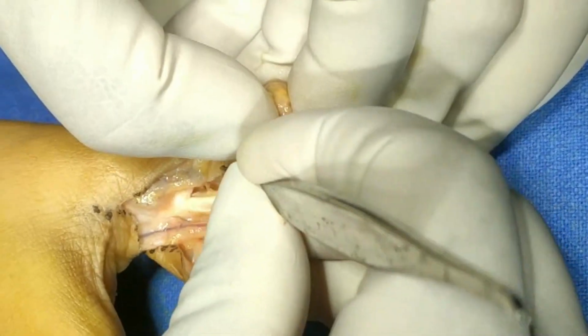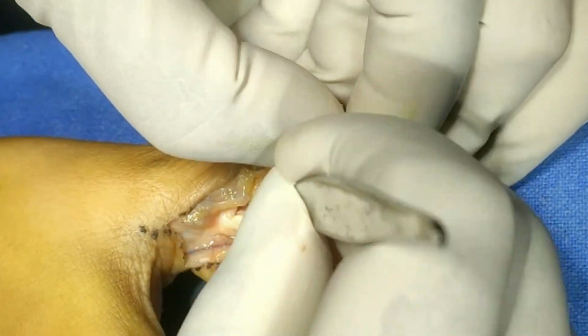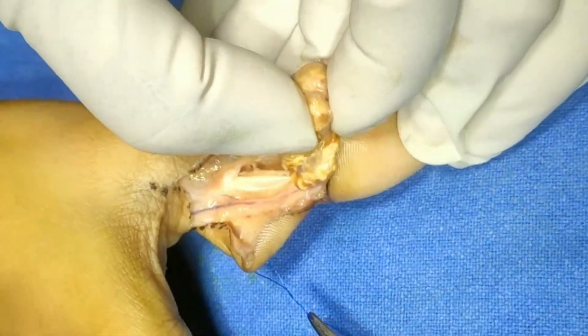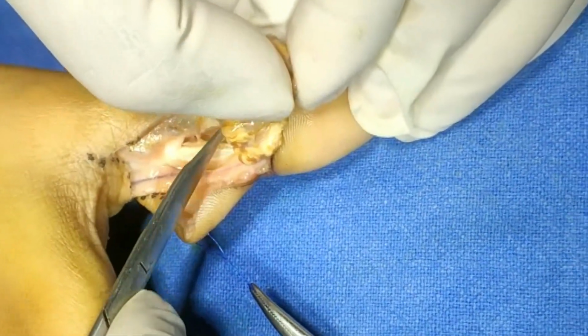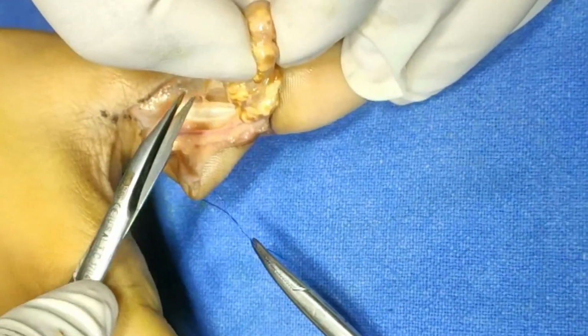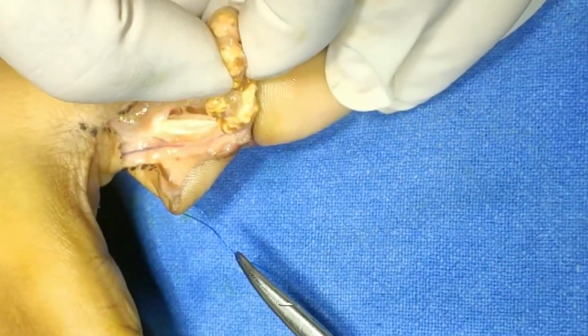The periosteum is kept with the tumor mass. Right? Sometimes this also originates from or is adherent to the ligament, and you have to remove that ligament also. This is a destructive procedure.